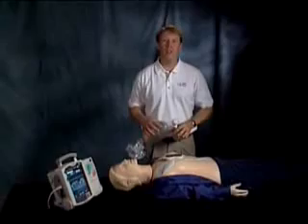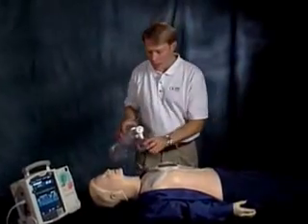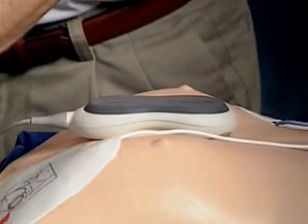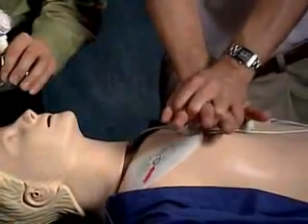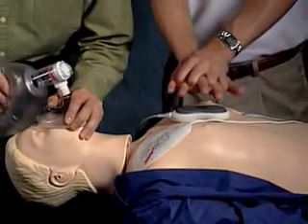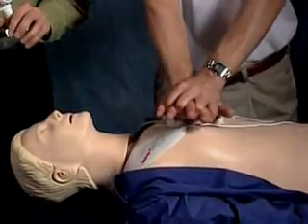The MRX uses standard defibrillation pads to detect changes in chest impedance that correlate to ventilation volume. As I ventilate the patient, QCPR uses these measurements to provide coaching on both rate and volume. With both ventilation rate and volume consistent with American Heart Association guidelines, audio coaching is silent. However, if either component is too high or too low, voice prompts and on-screen indicators direct you back to the target range.